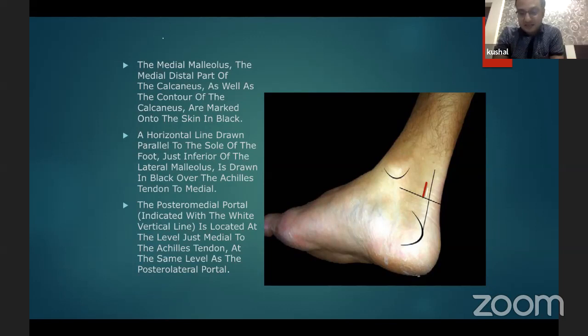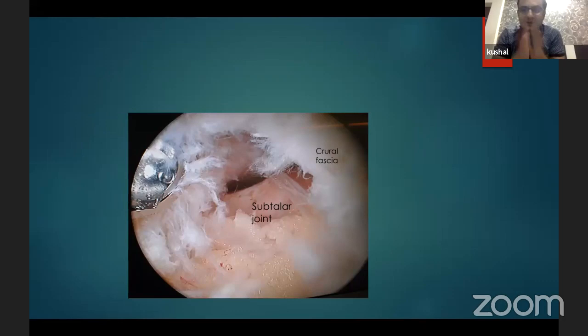So once you have done that, and I would comment Sundar on this very nice slide that he showed when he does the triangulation, your medial, your lateral portal, which is the viewing portal, the trochar goes in, and for the medial portal, you put your mosquito or your shaver and you hit the scope and you gently go down and track along the scope. And once you have triangulated, you either start shaving or you can use your artery and start spreading.